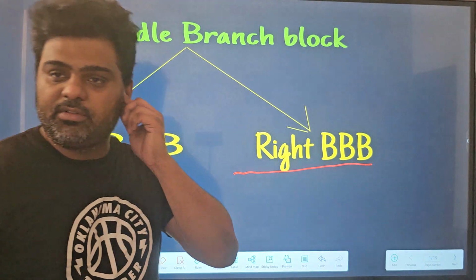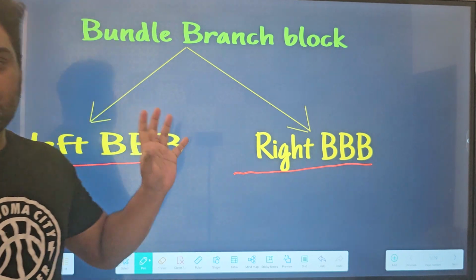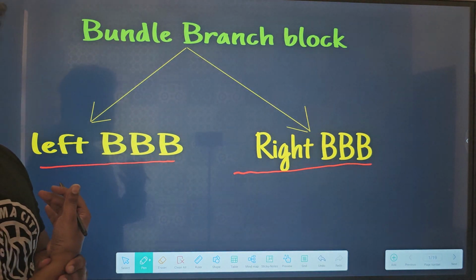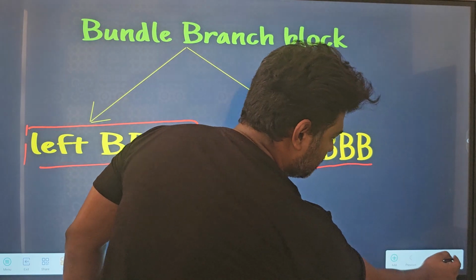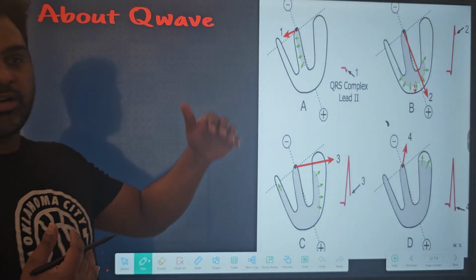इन आप जितने भी ईसीजी के वीडियोस पढ़े हैं ऑन दी इंटरनेट, दिस इज द मोस्ट एग्जॉस्टिव कवरेज ऑफ लेफ्ट बंडल ब्रांच ब्लॉक। ओके, none of the videos have discussed left bundle branch block in this much detail. So start करते हैं left bundle branch block. Okay, so before starting left bundle branch block we have to know how depolarization current is formed.